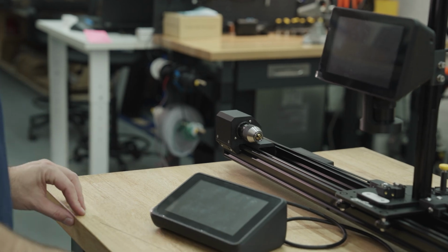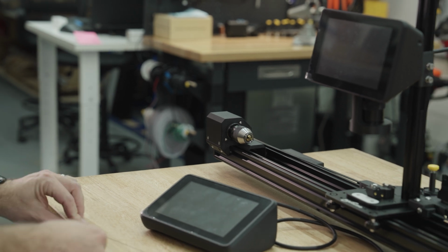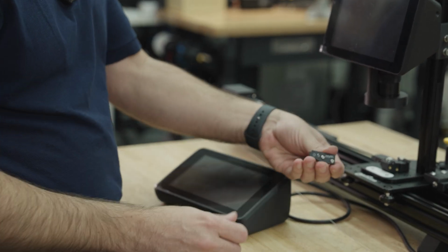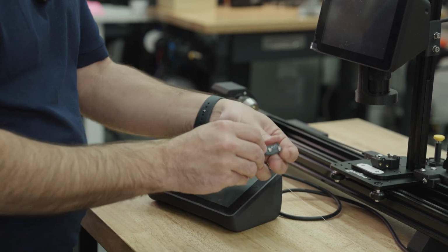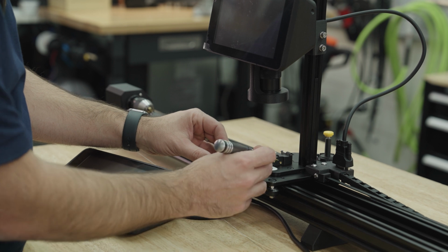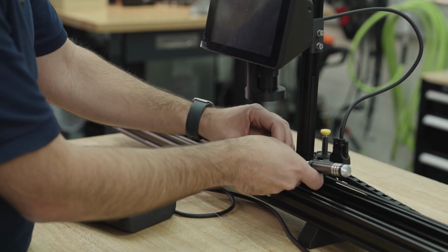The first thing I'm going to show you how to do is how to load the mandrel. This is a 0.5 millimeter mandrel, so we're going to use our smallest mandrel guide, the 0.5 millimeter guide. It threads on either side of the wire payout. For this example, I'm going to put it on the right.